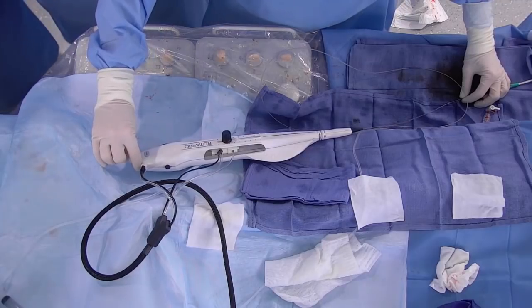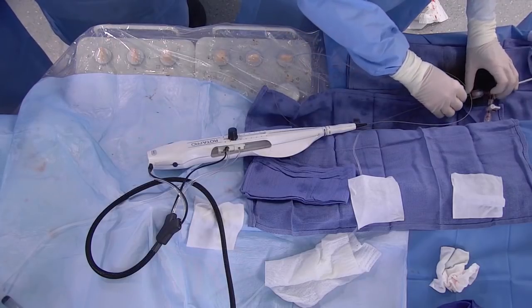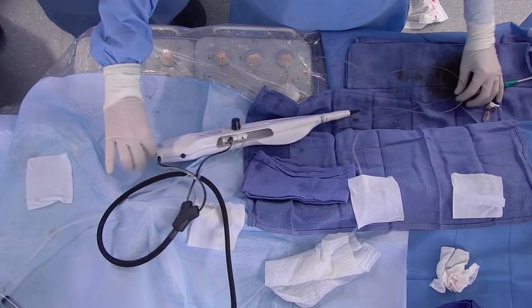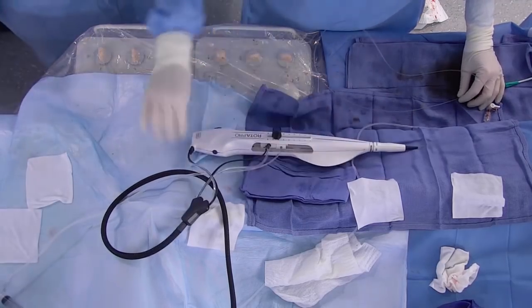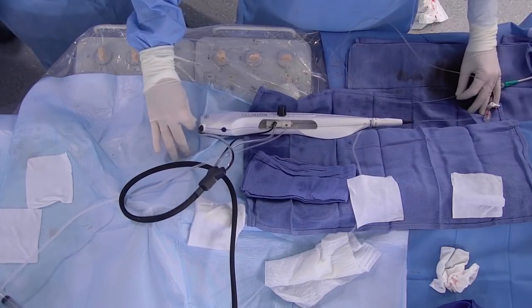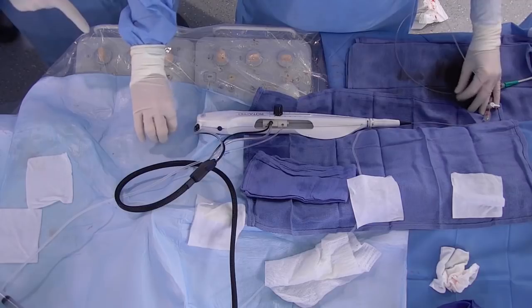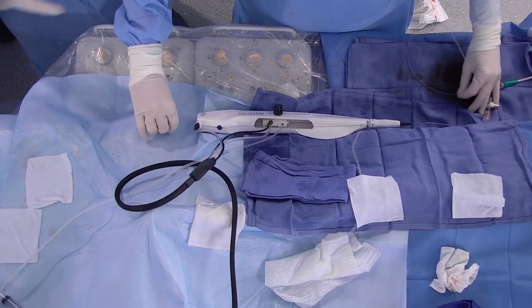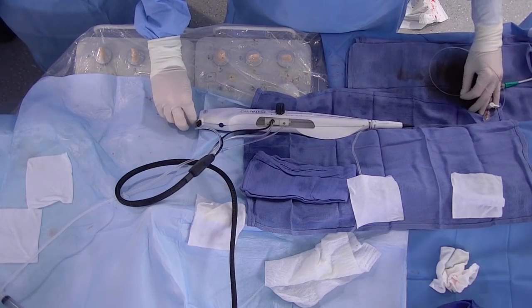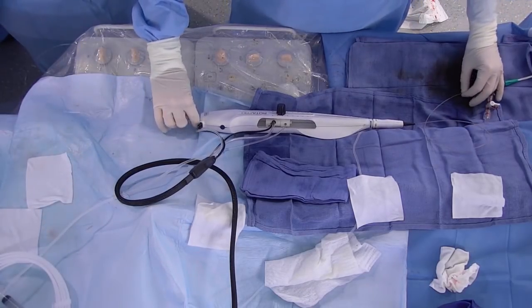Just to show what I do, I make a loop with the burr and I pull the wire, and thanks to that I can advance it. Looking at Nicolas, I have a different technique, but his is quite convenient, because with these two hands, he can manage it all. He doesn't need any help. I don't know whether you can appreciate, the loop is becoming bigger here, securing the loop with the rotor wire clip in the hose there. Some operators place the distal part of the wire inside the plastic. Yeah, I do like this.